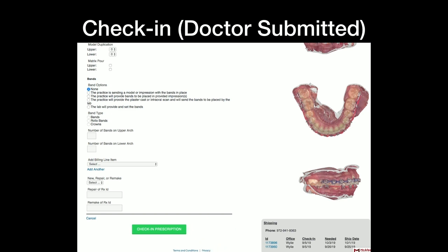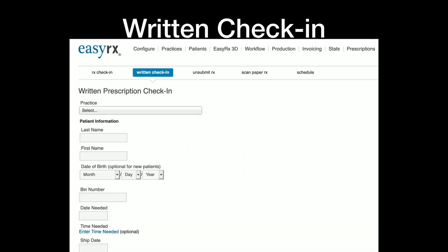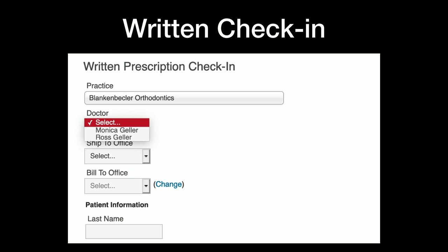And then you check in prescription. Okay, so written check-in, so that the left side here, same thing, but you choose the practice, and you can choose the doctor. You can choose ship to office, bill to office. So all those you enter in, or the doctor enters in, and they say, deliver on this date, but to this office. And the great thing is when you go to check them out, it will invoice out and give you where to ship each batch and give you a list. So you don't have to accidentally ship appliance to the wrong office and vice versa.